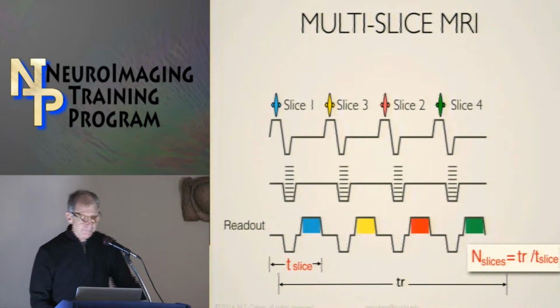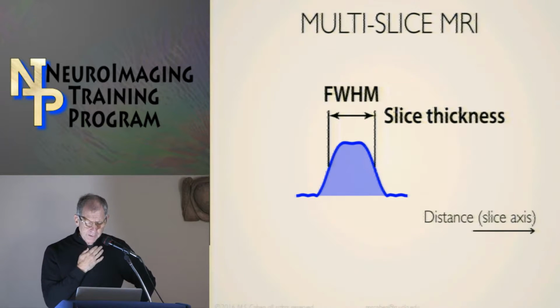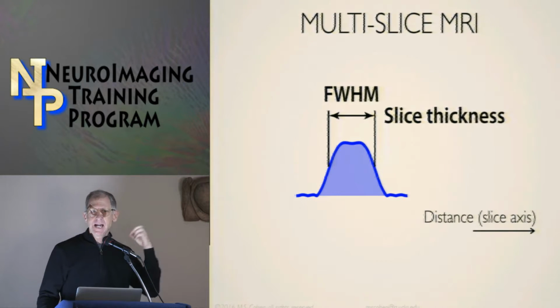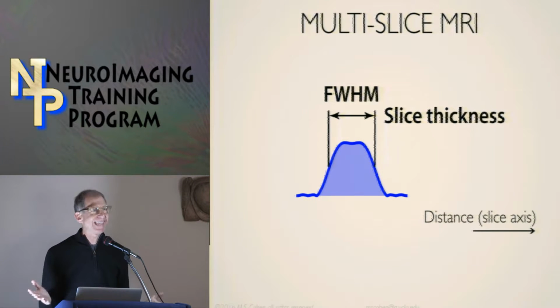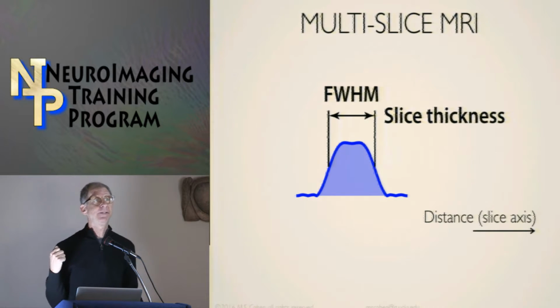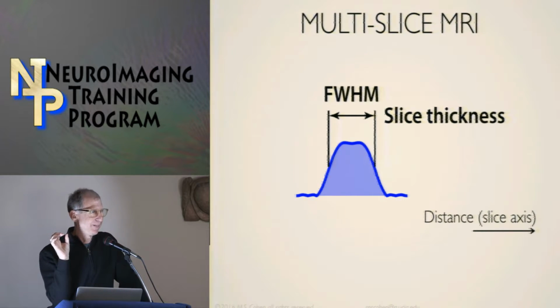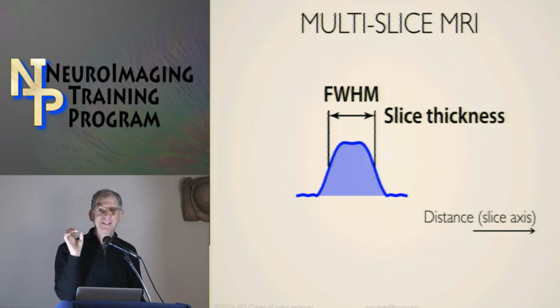All right. Now, there are a couple of issues with frequency selective excitation. One is that in order to make a signal of a precisely known range of frequencies, right, you want to go from, say, 100 hertz to 150 hertz and have nothing else. You can do that, but it requires an excitation pulse which lasts for infinite duration, which turns out to be inconvenient. And in fact, the typical approximation to infinity for the time of the RF pulses in a scanner is something like 2.5 milliseconds. So it's pretty far from infinite time.